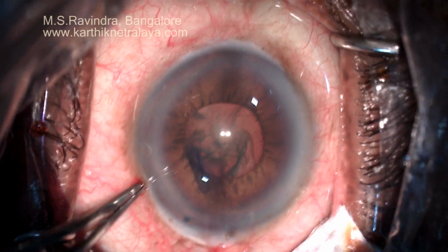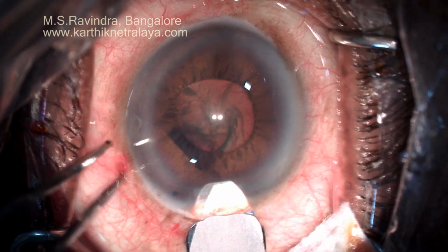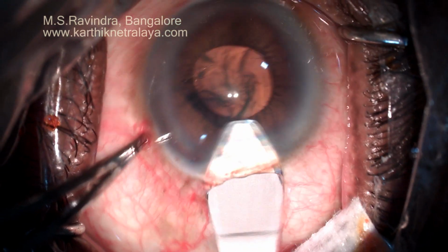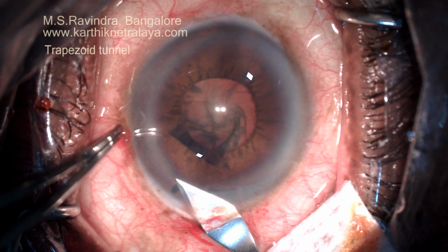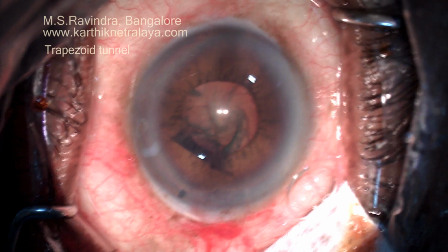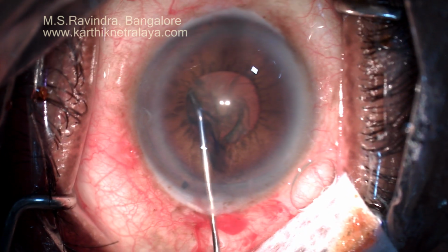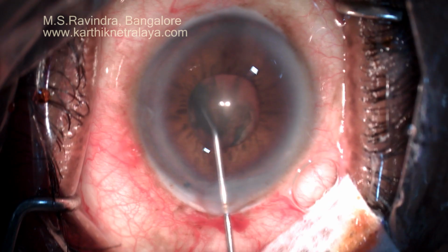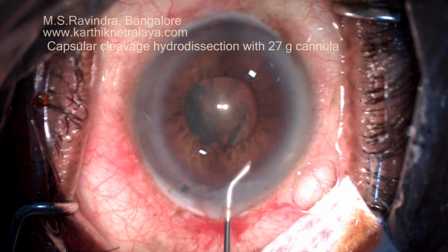perforation. An adequate sized rhexis is done under the iris. The internal lip of the tunnel is now enlarged minimally so that you have a trapezoidal tunnel. Hydrodissection is performed very carefully, ensuring that the fluid does not seep through the zonules.